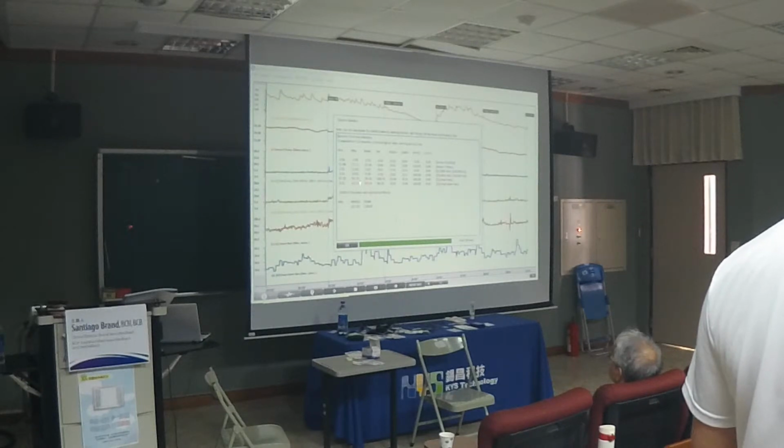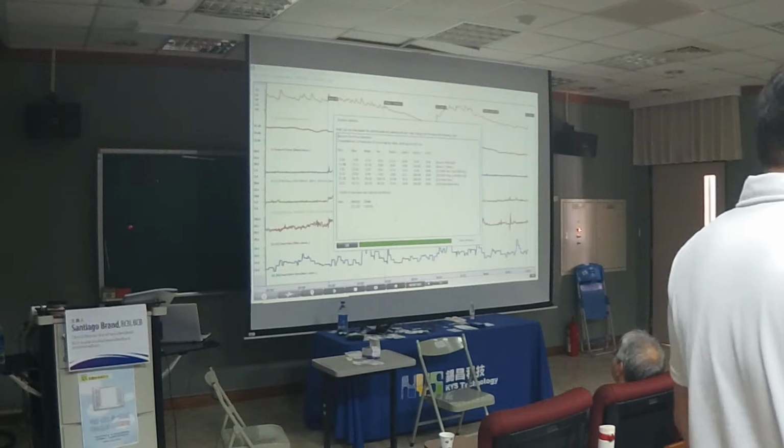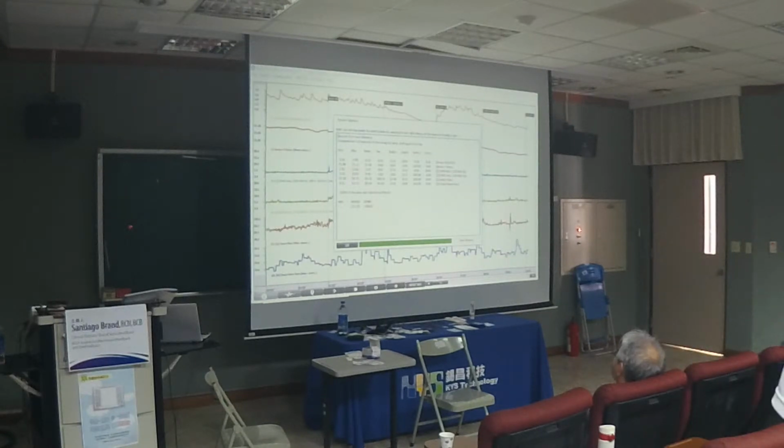So the respiration is going to go up to 23, 25, 27 breaths per minute, because it's natural. It stresses them out, right? So if you have somebody like Willie, next time we'll do another type of test that stresses him a little more. But look, the shoulders went to 9. From 5 to 9. So we have some tension there, right? So the math stressed him a little bit. Even though he was doing well, he got stressed a little bit.